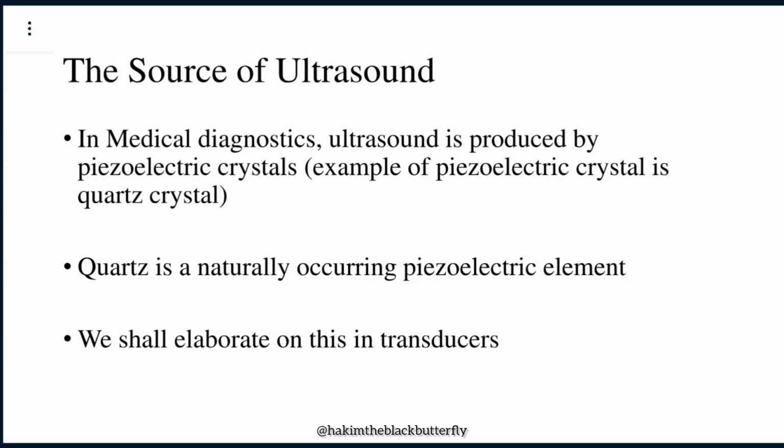They can convert electrical energy into mechanical energy, which is ultrasound. When this ultrasound goes into the body, the structures reflect it. The echoes come back to the transducer. The echoes are still mechanical energy. They come back to the same transducers. And then these transducers convert these echoes, these mechanical waves, back into electrical energy.